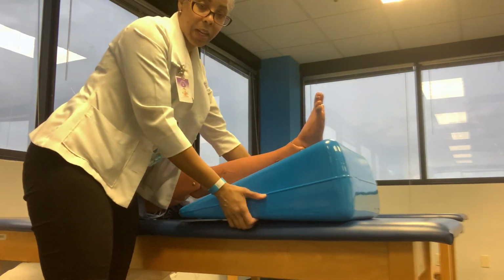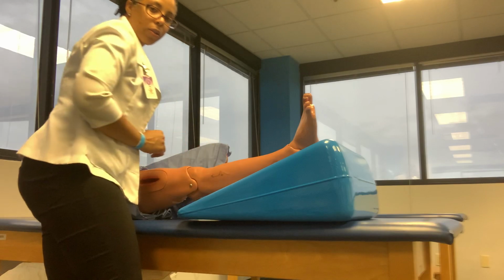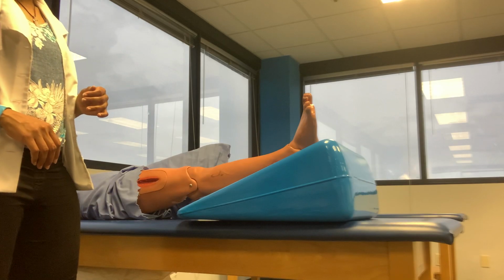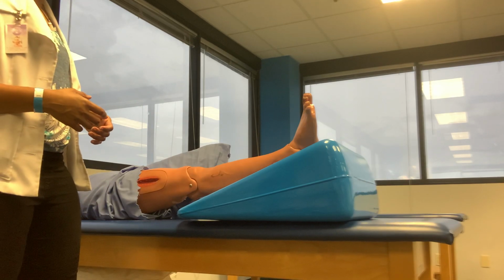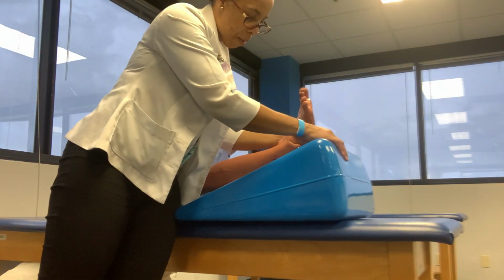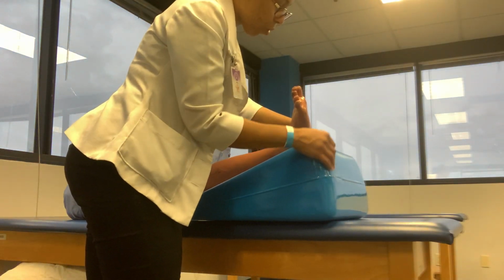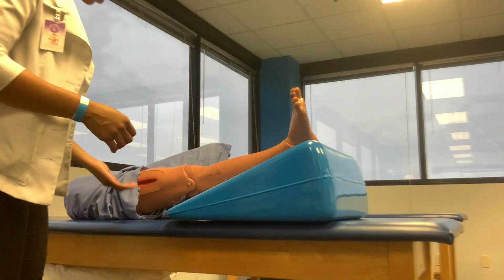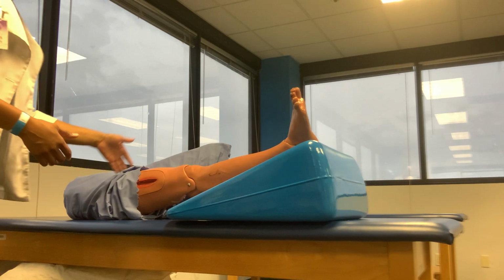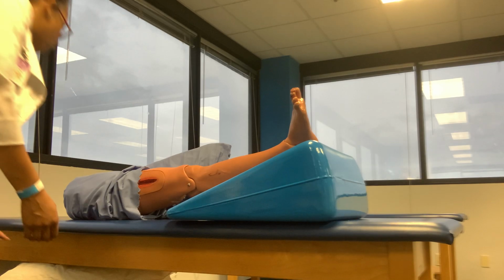Now, their other extremity, we'll deal with afterwards. If the patient would like, you can have them bend that other extremity while they're lying on the table, or you can give them a pillow underneath that knee so that we can protect their lordosis. Now, we can't have any gaps, so once the wedge is supporting the majority of the leg, because you don't want any of the limb hanging off the edge of the wedge, then we'll use pillows to build up the rest of the space, because we're trying to get that limb nicely elevated so it's at least in line with the level of the heart so that we can get adequate venous return.